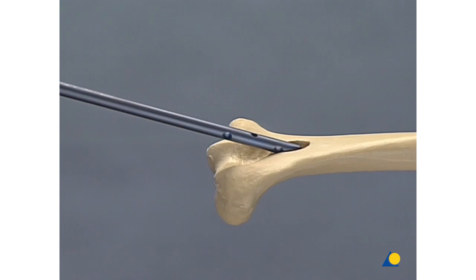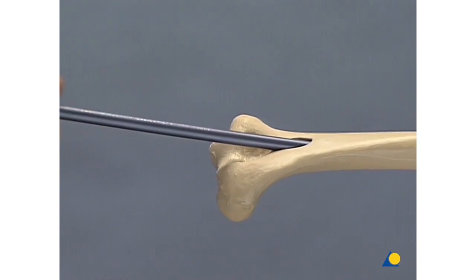Insert the nail assembled in the same manner as shown in the section for the antegrade insertion.